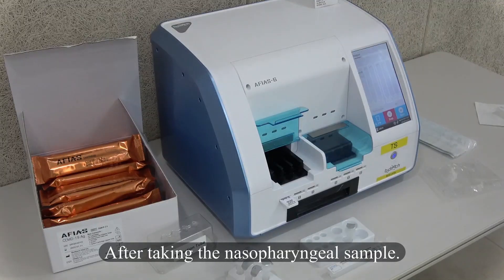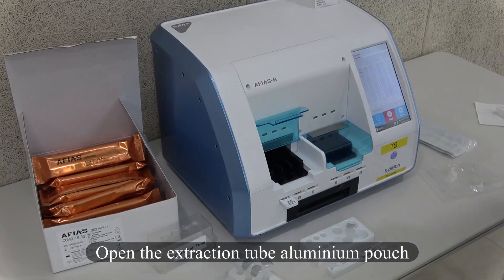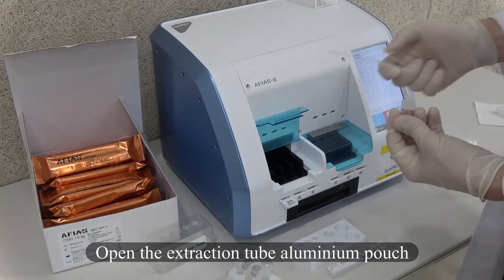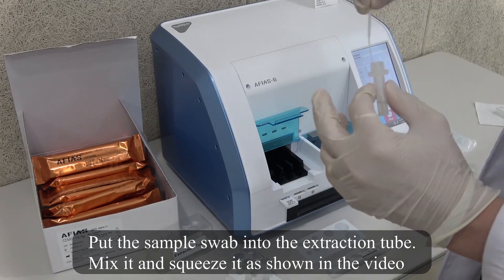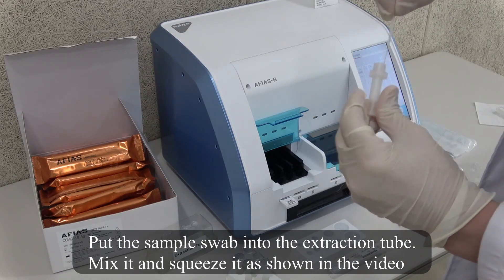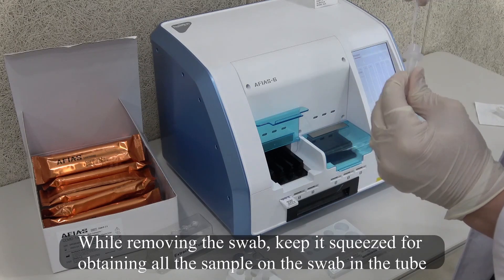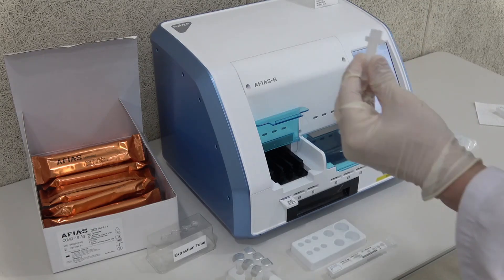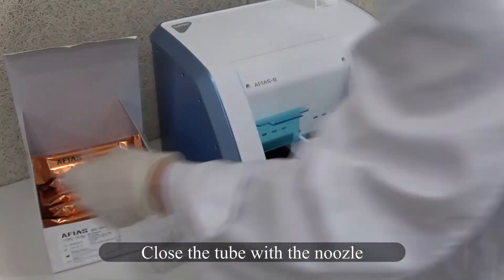After taking the nasopharyngeal sample, open the extraction tube aluminium pouch. Put the sample swab into the extraction tube, mix it and squeeze it as shown in the video. After removing the swab, keep it squeezed to obtain all the sample from the swab into the tube. Close the tube with the nozzle.